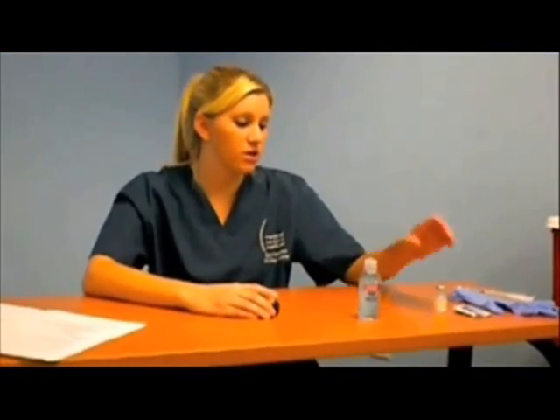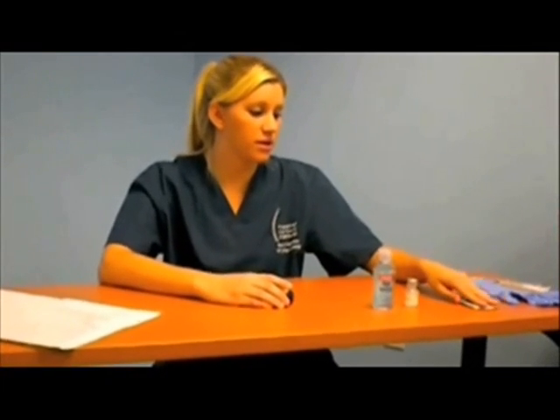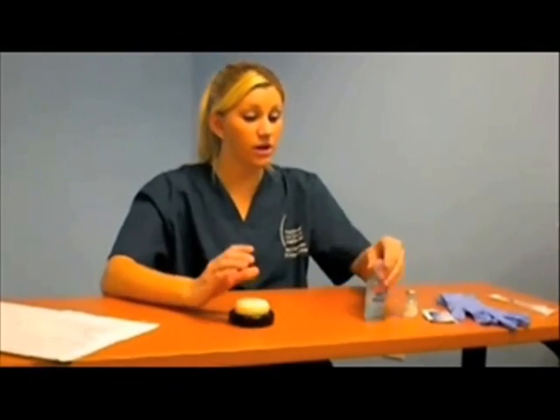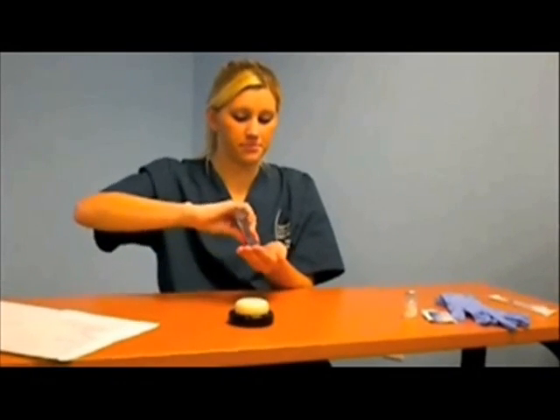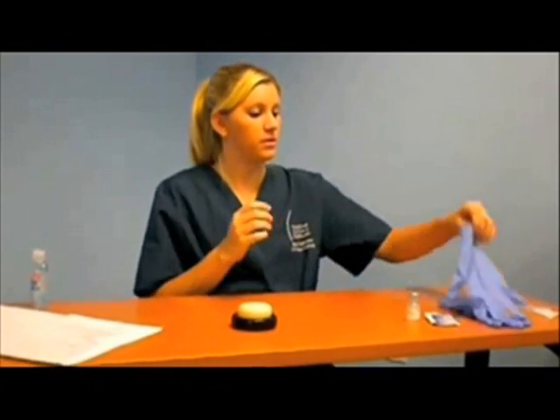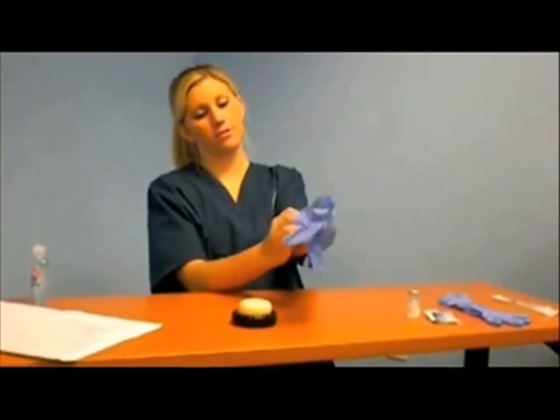For preparations, you're going to need hand sanitizer, your medication, alcohol pads to clean the site, gloves, and a tuberculin syringe. To start, I'm going to sanitize my hands. And when they're dry, I will put on my gloves. Put on my gloves now.